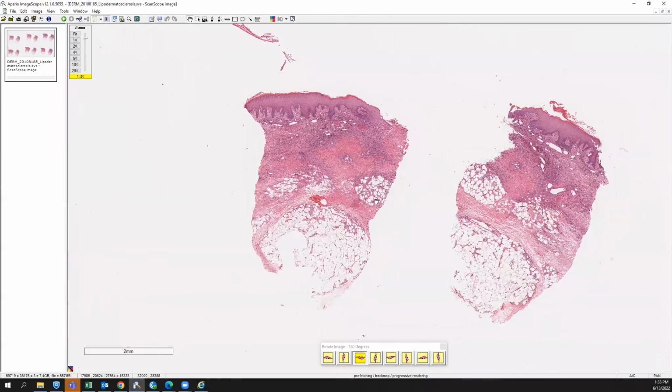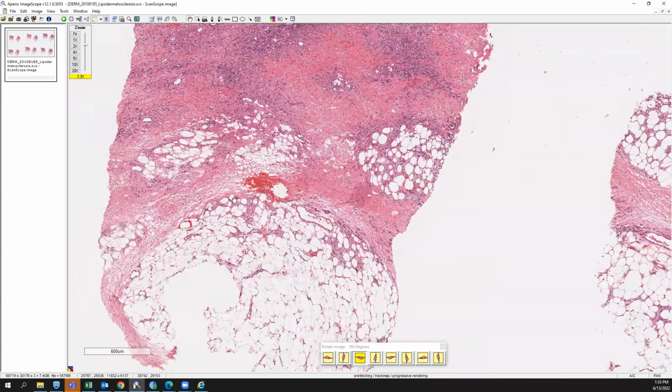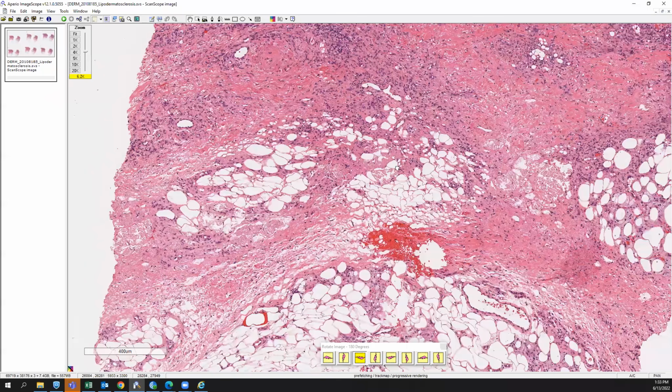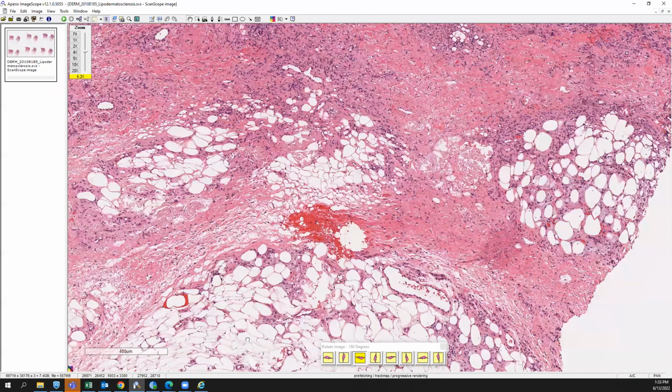On this biopsy, you can see inflammation that appears to be in the mid-dermis, superficial mid-dermis, but also you'll appreciate some interlobular proliferation, or at least inflammation here in between the adipocytes, and up here as well, you'll notice a kind of degeneration, eosinophilic change in between lobules and in and amongst the fat cells as well. So it looks to be a mixed kind of lobular septal process. It's a little non-specific because you have so much eosinophilic degenerative change here.